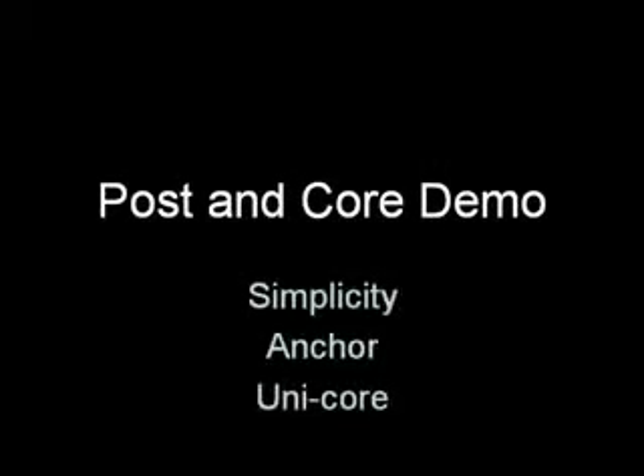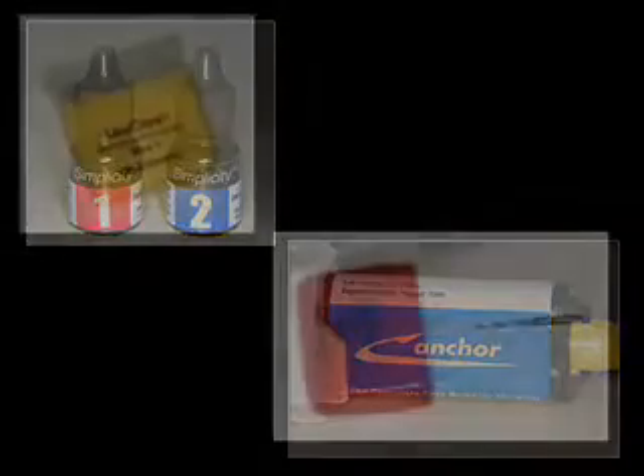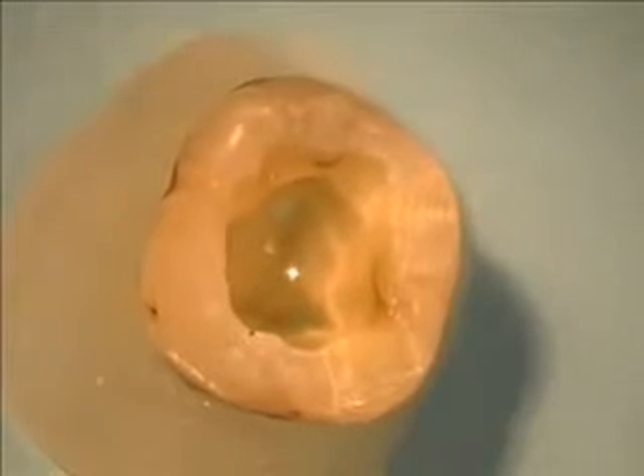The following is a demonstration of a post and core placement using Simplicity, Anchor, and Unicore. Simplicity and Anchor are from Apex Dental Materials, and Unicore is a post system from Ultradent.